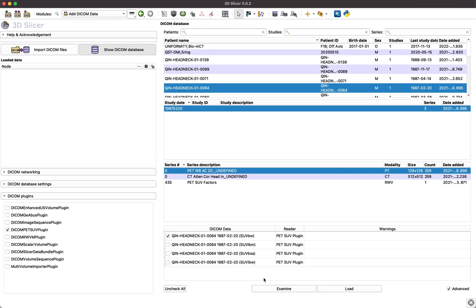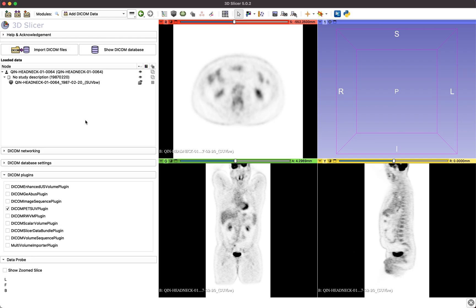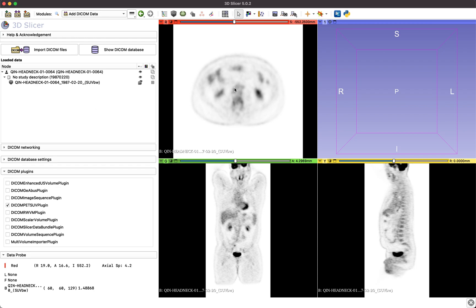These additional SUV normalization options are only available depending on the information stored in the PET scan's DICOM header. After selecting the SUV normalization of your choice, you can load the data set. The PET SUV plugin will calculate the SUV normalization factor, normalize the uptake values in the data set, and store the normalization factor in the DICOM database for future reference.